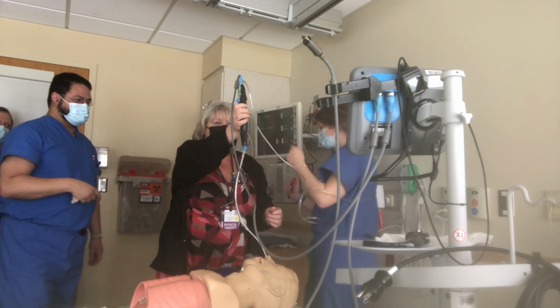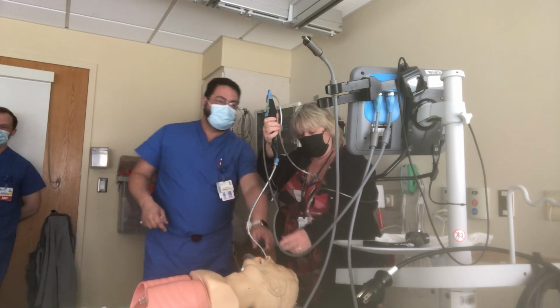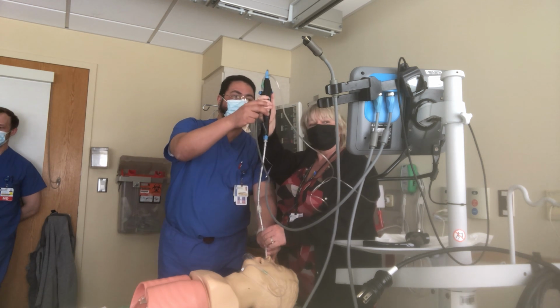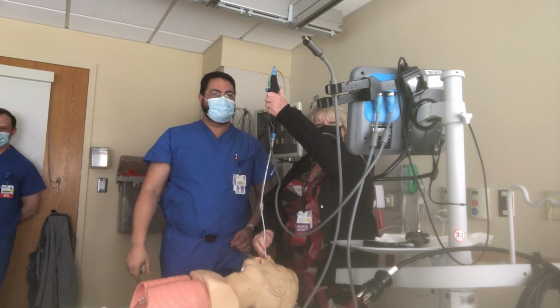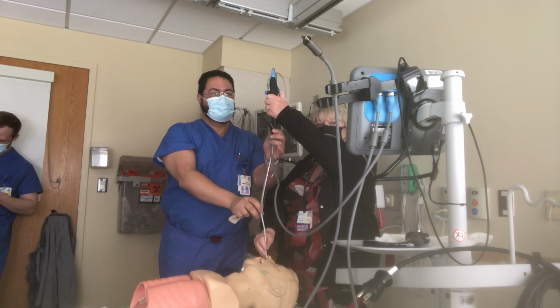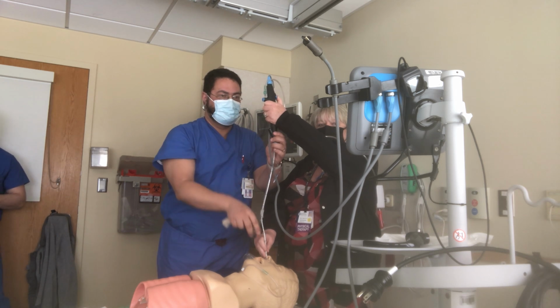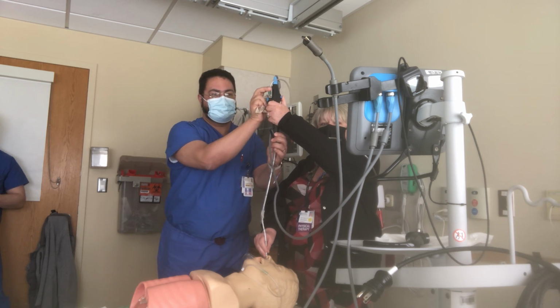Use your dominant hand, just change places. There we go. All right, so your airway is here, okay? Yeah, hold it here with the right hand. Change hands. This is the right and this is the left. Flex, so bring it down. Oh, too much. Push. Turn. Push it with this hand, yeah. Keep pushing. See, it's right there. So what we're gonna do, we're gonna retroflex, the opposite of this move. So bring this lever up like this, so we can avoid this booger there.